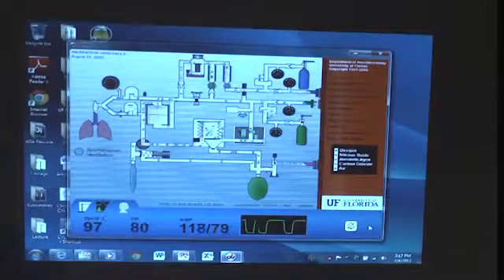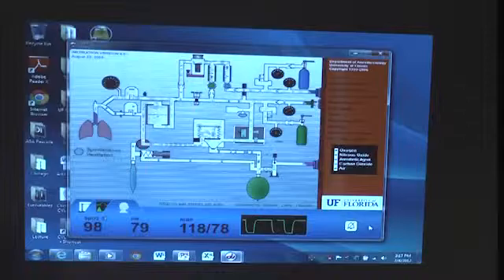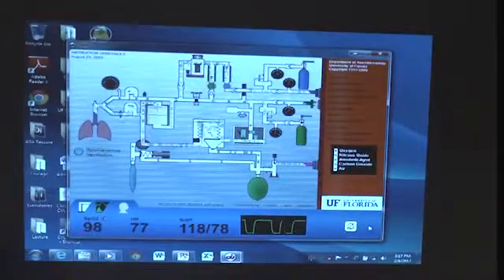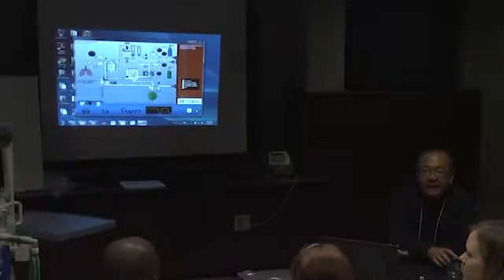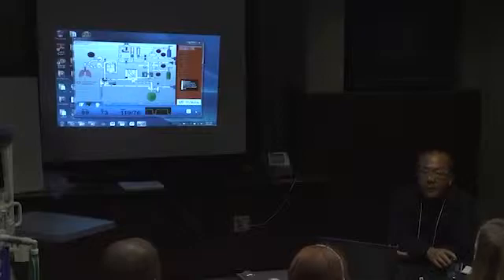Okay, first of all, let's go over what you do in the pre-use check. I think you guys need to bone up on your pre-use check. The O2 sensor would detect it, and when you do a pre-use check, you check the pressure in the front and you close the cylinder. So a pre-use check would not. The problem is not with the cylinder. The problem is in the pipeline, right? Why are we concerned about what it is that's in there?